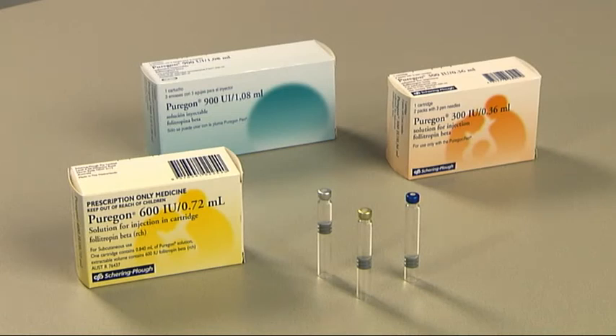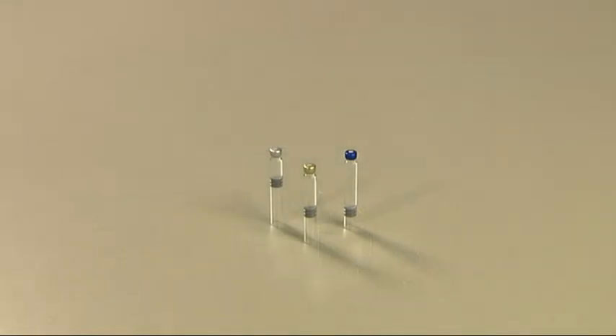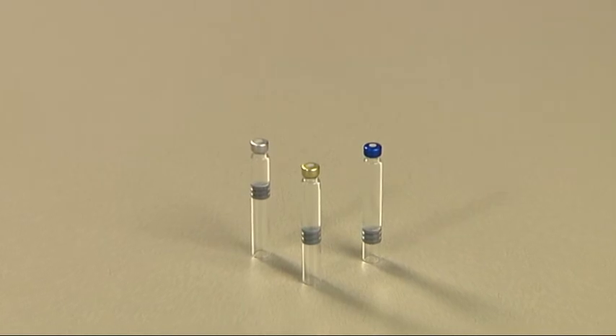The colour of the metal cap indicates the contents of the cartridge. A silver cap indicates 300 international units or IU. A gold cap indicates 600 IU, and a dark blue cap indicates 900 IU.